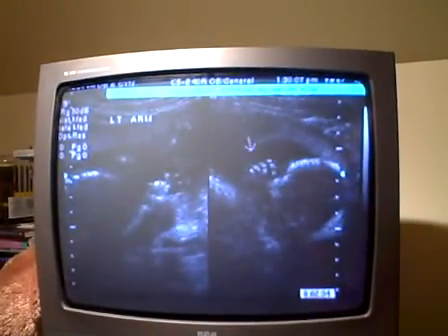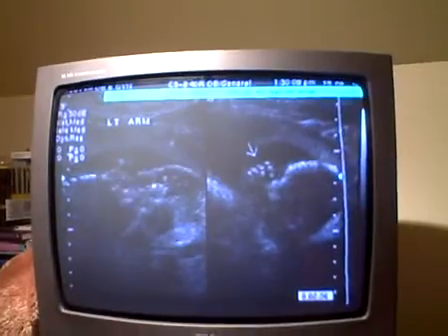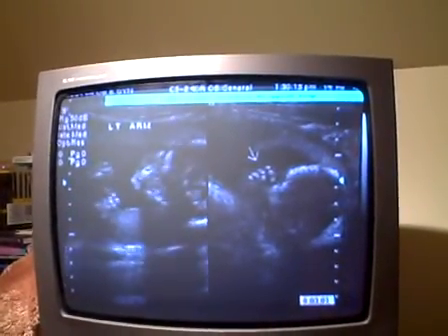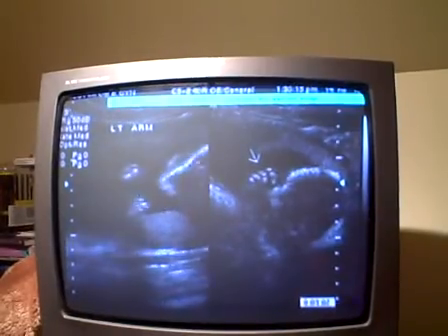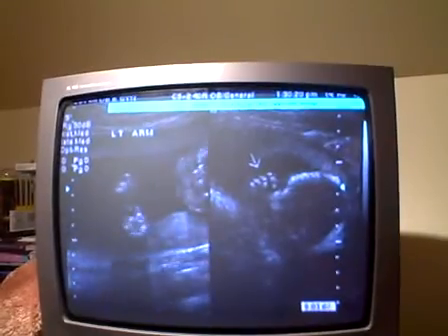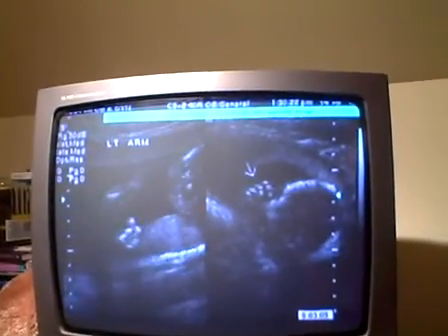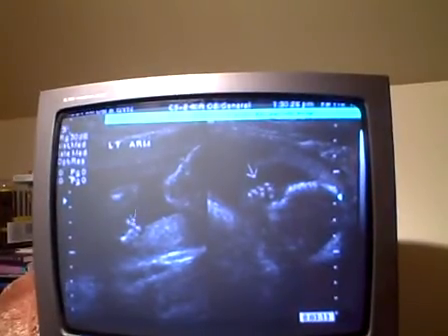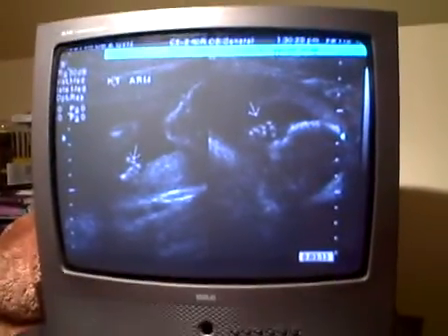There is a hand — see the fingers? What the arrow is pointing to? And now he's moving both his hands and she's going to look for the other one, get a little bit more focus. She'll identify that one when she's got it. If he would hold still. And there's the other hand. So we have two hands — this is a good thing.